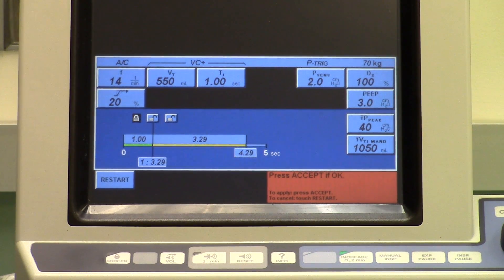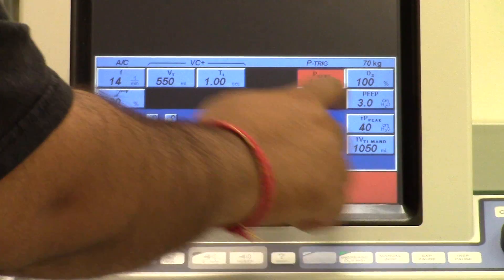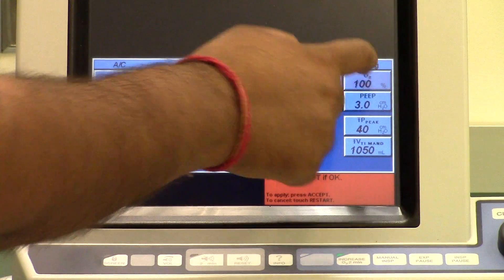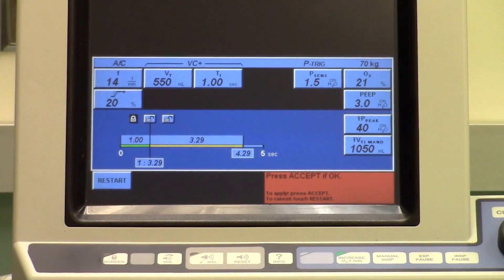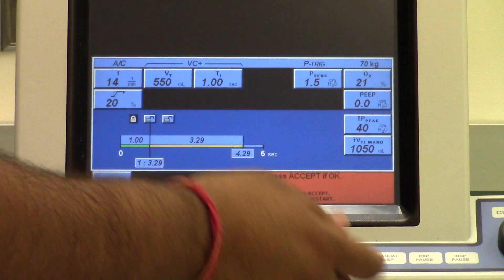For the pressure sensitivity (P-trig), it's going to be set to 1.5 — that is the pressure sensitivity, and it is actually negative 1.5. You will see it as 1.5 but there is a negative there. This is our FiO2 — we're going to set it to 21%, which is room air. For PEEP, we're going to keep it at zero. Now we can press accept — that will start our settings.